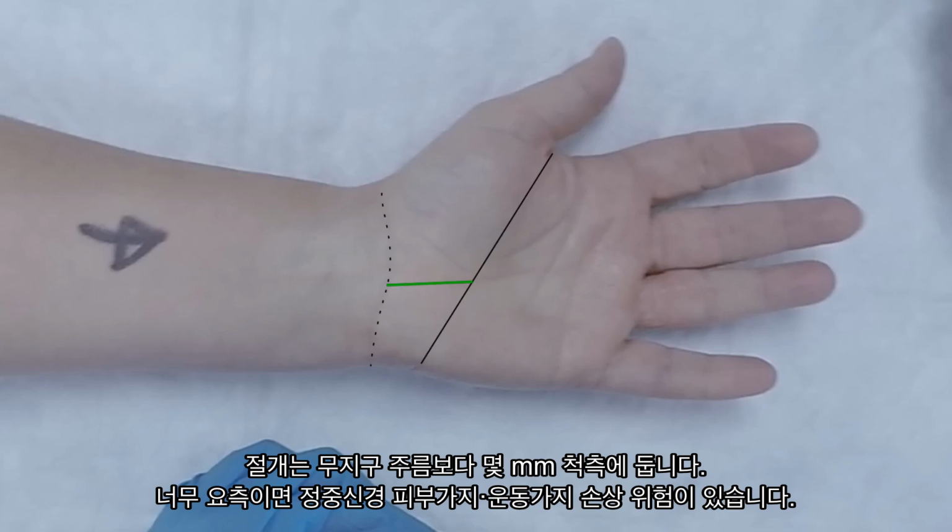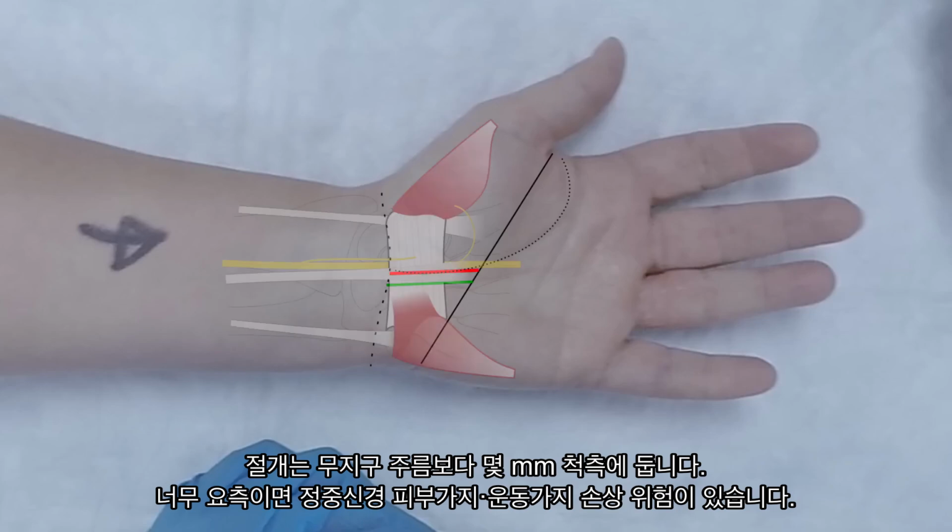You'll notice that the incision is a few millimeters ulnar to the thenar crease. If our incision is too radial, such as in the crease itself, we risk damaging mainly the palmocutaneous branch of the median nerve, and to a lesser extent the recurrent motor branch distally. It also puts any scarring directly on top of the median nerve, which we want to avoid.